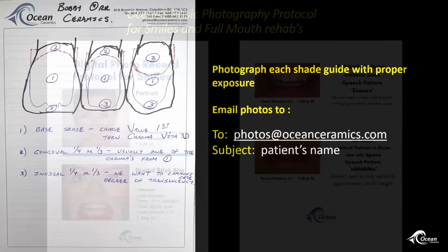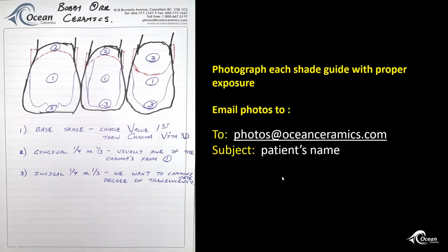Perfect. Okay. For shade records, I want to do a very quick review here, because what we find, once again, we get into the digital trap. Okay, just because it's digital, it's got to be perfect. But at the end of the day, we're making a piece of art, ceramic art, that we're sending back. So if you would like nice, vital shades to emulate more like teeth and not as much like shade guides, what I want you to do is always look at teeth in 3 zones or more.